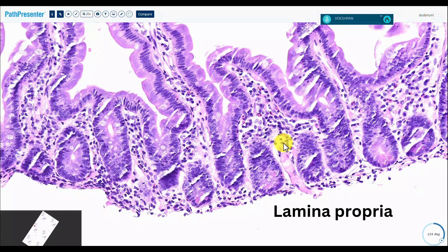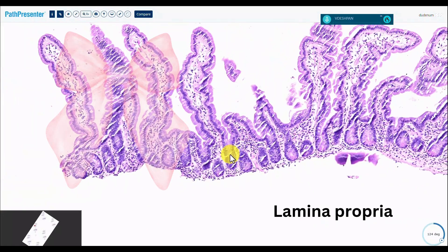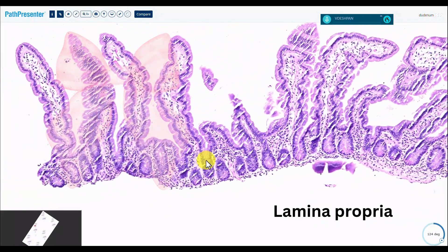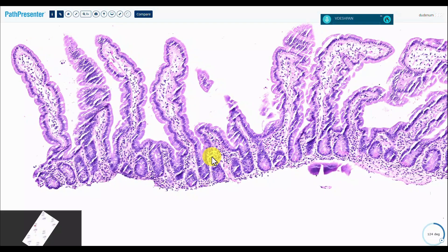This is normal lamina propria. There is a sprinkling of lymphocytes and plasma cells, mostly through the apical compartment. It generally gives you this very pink look. If you see a blue look, you're talking of an expanded lamina propria, and that's another feature of celiac disease.